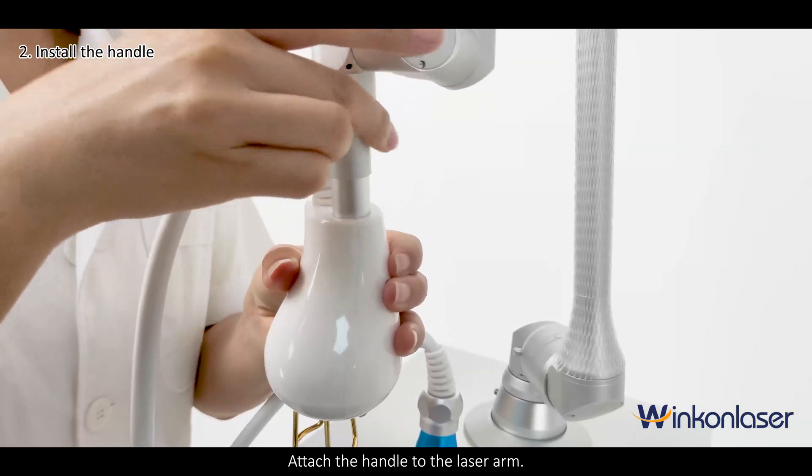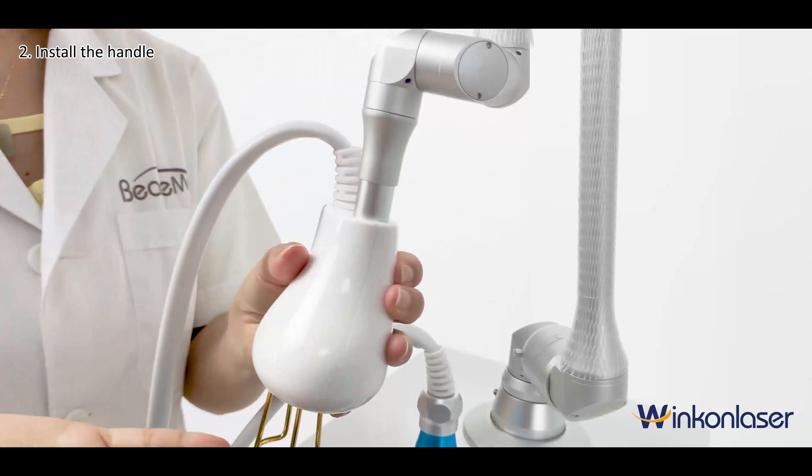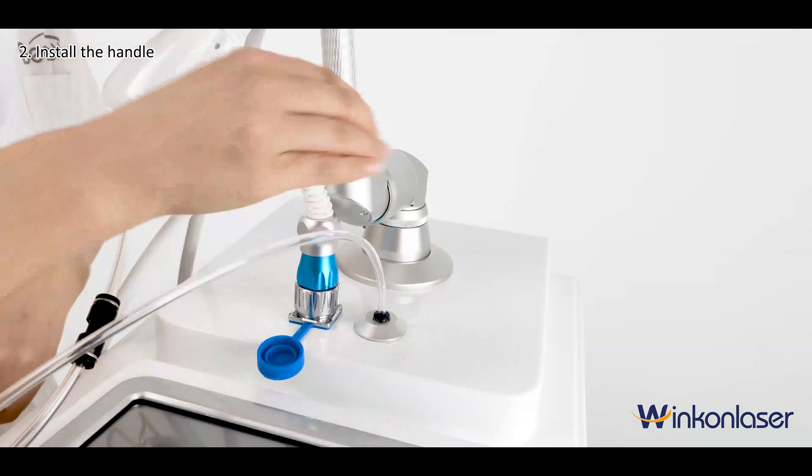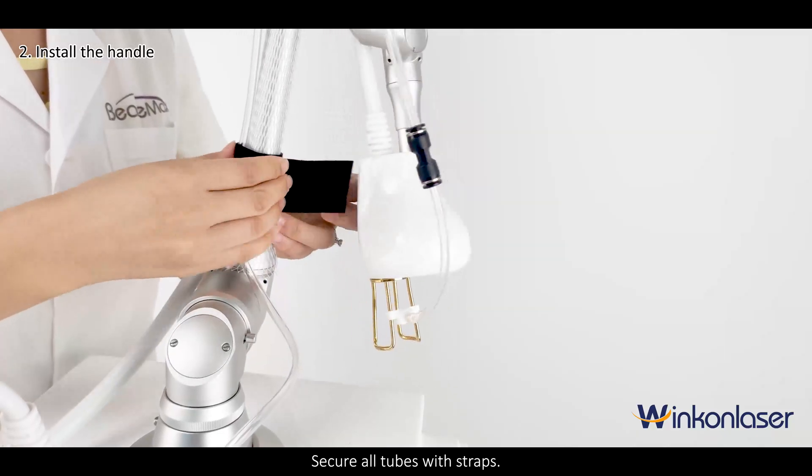Attach the handle to the laser arm. Connect the tube to the air outlet. Secure all tubes with straps.